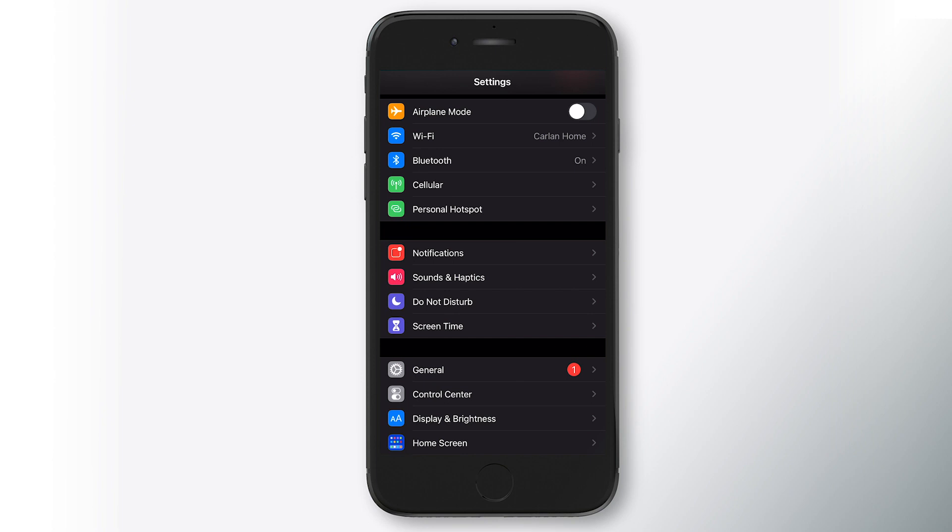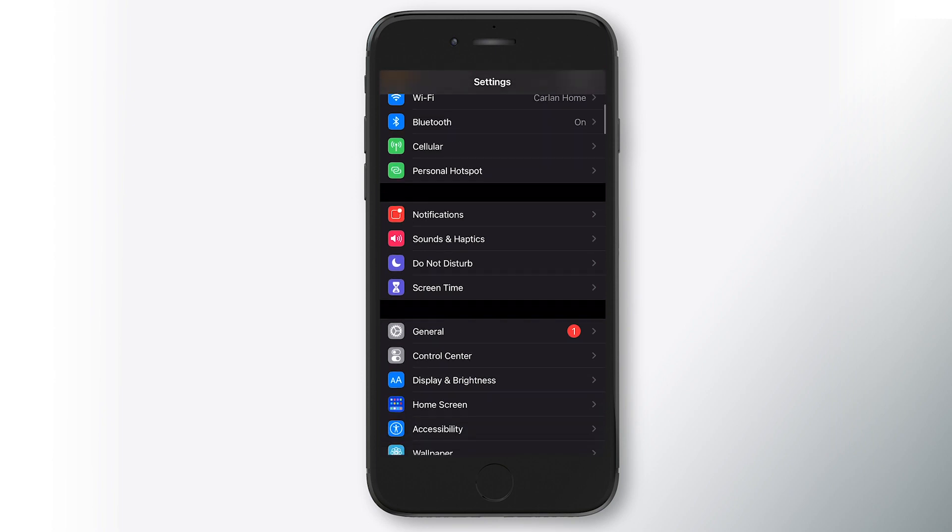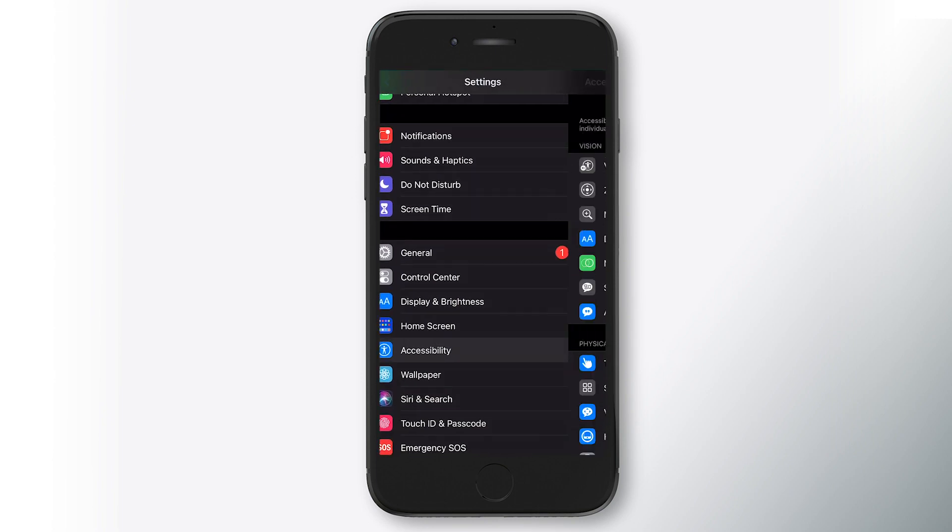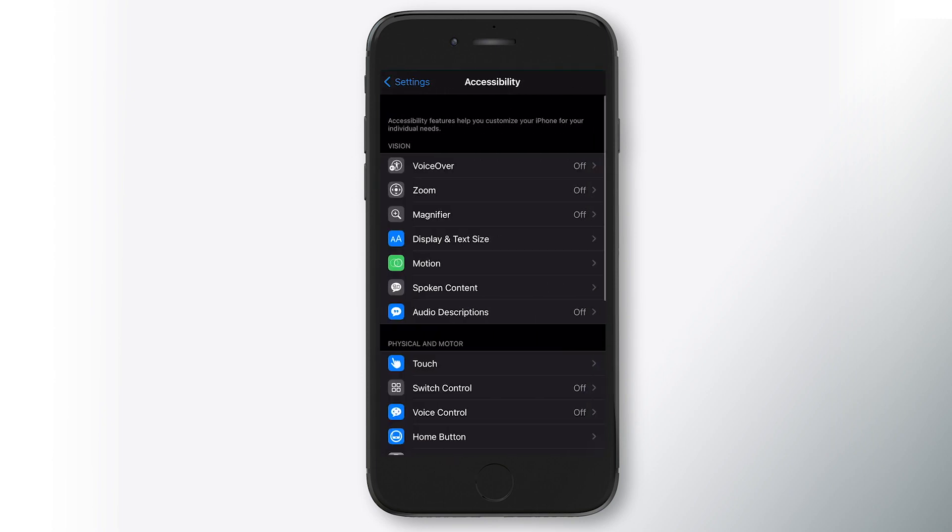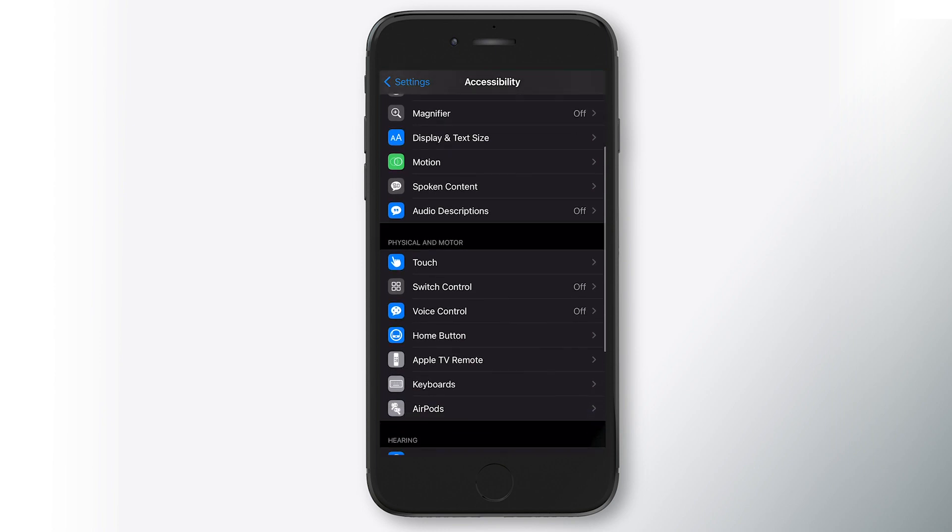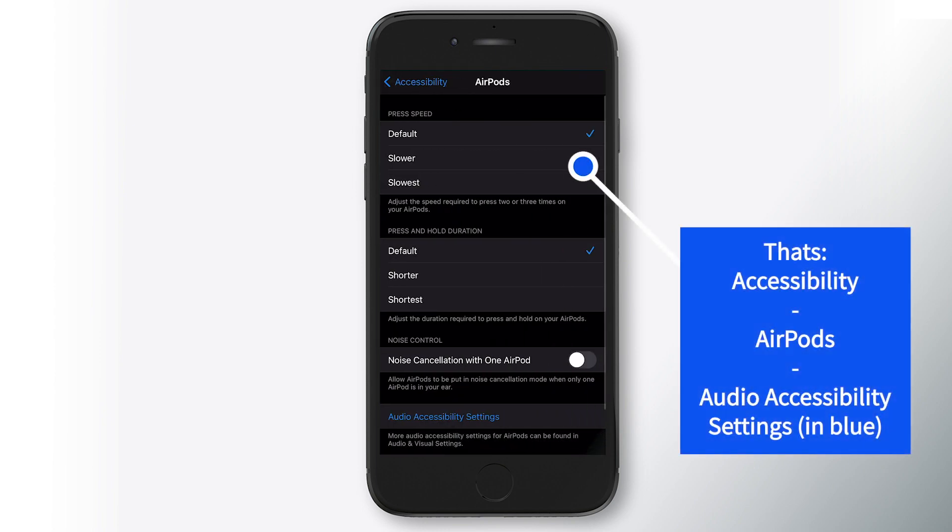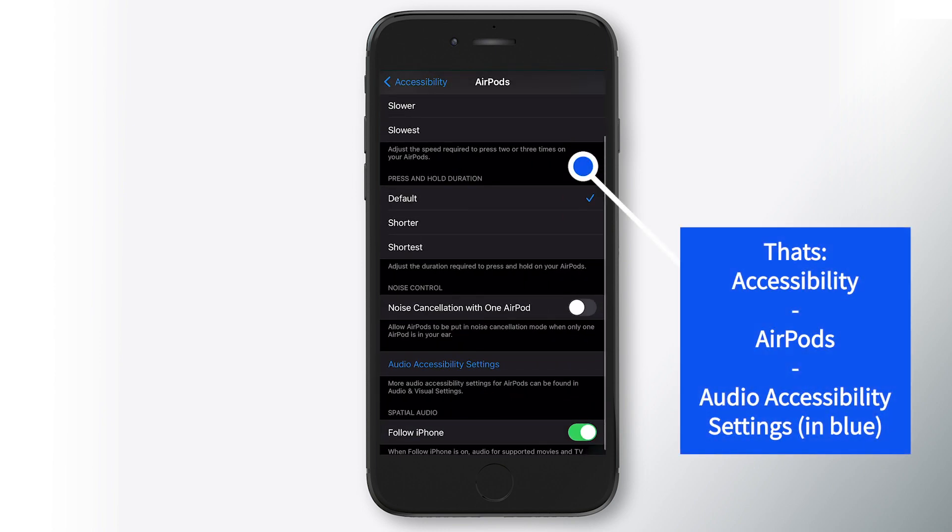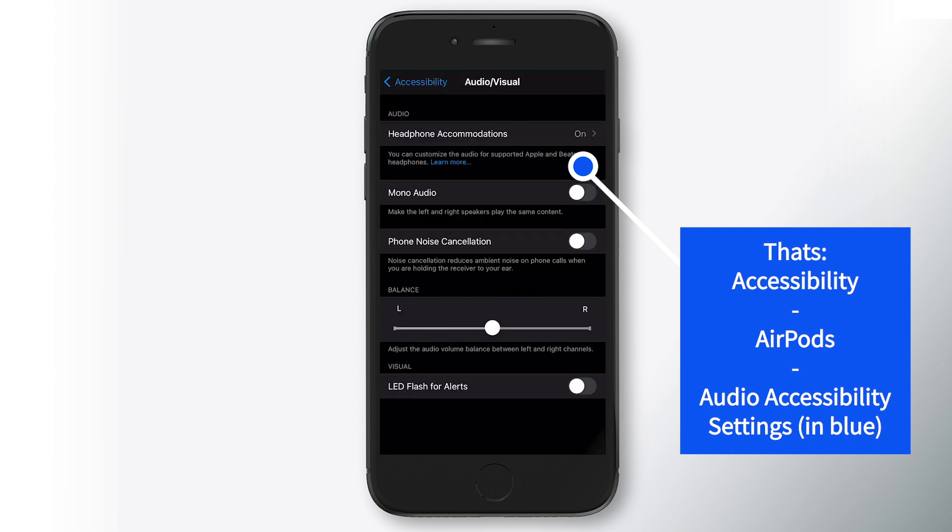So we're going to hop into settings. What you're going to do is scroll down to accessibility. This is one way to get to it. Accessibility, AirPods, and then down at the bottom here, audio accessibility settings.